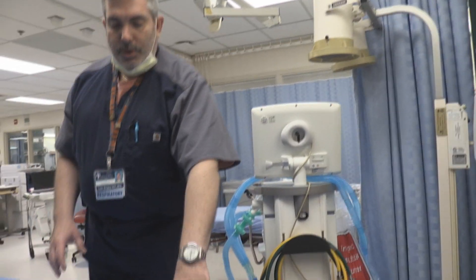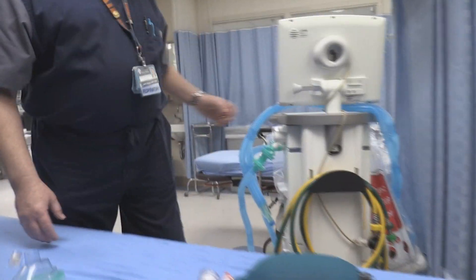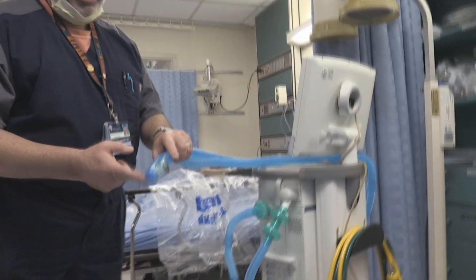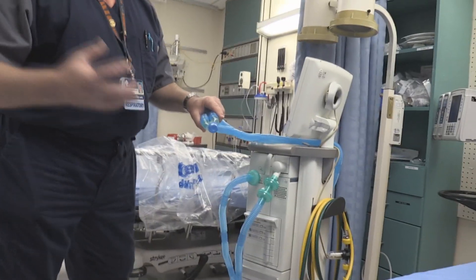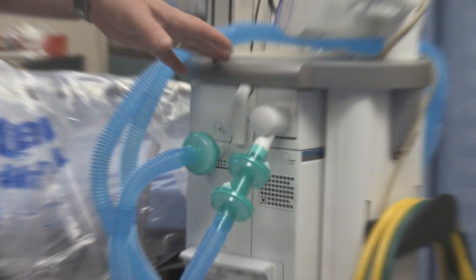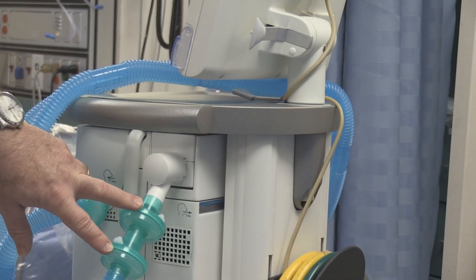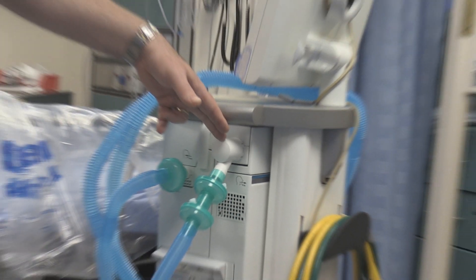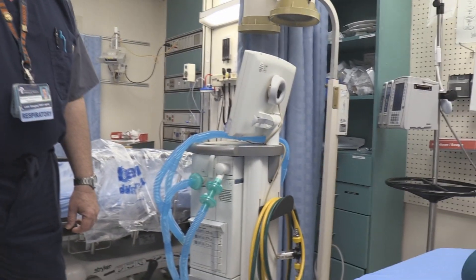So we're manually ventilating with our filtered ambu bag and we would immediately switch to the vent. You could put your filter here at the Y between the ventilator and the patient; however, you still have to worry about secretions. So ideally we like to move the filter towards the vent — you can filter the inspiratory side — and a lot of times we will double filter the exhalation side prior to the exhalation valve, which protects the transducers in your exhalation valve.